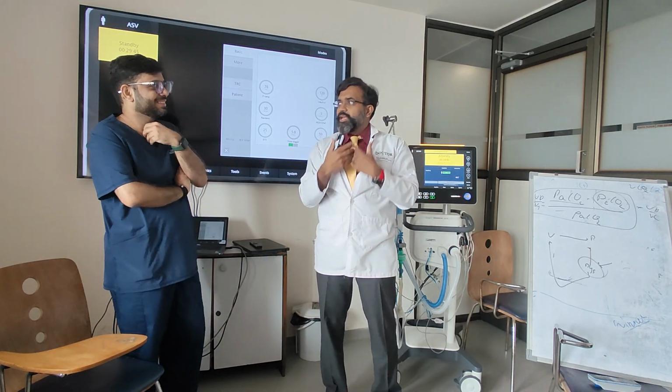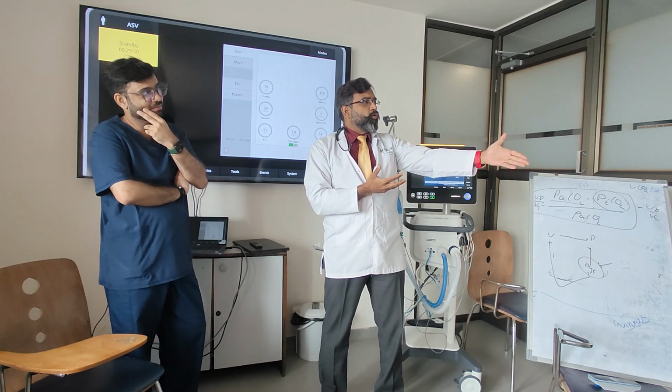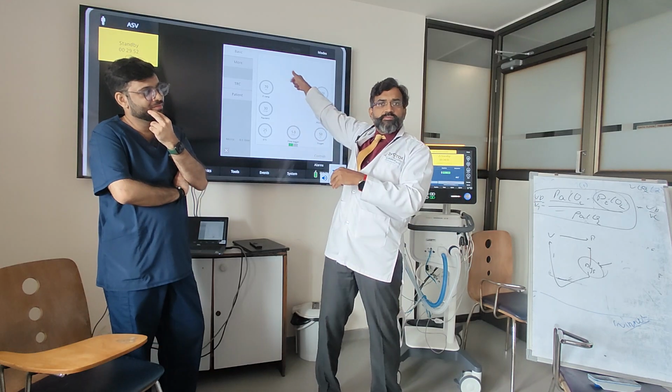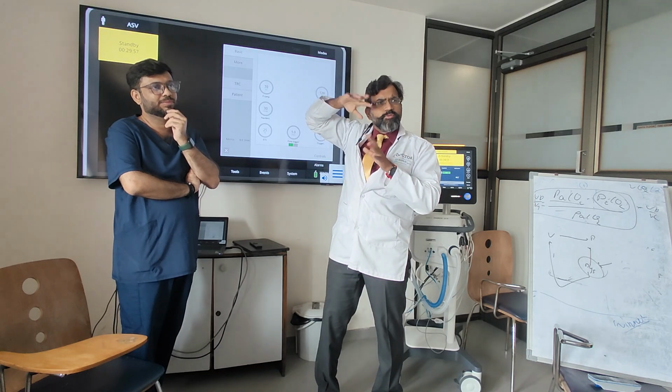I have an example. Why am I telling you this? Because tomorrow when you are ventilating a patient bedside, you should not think, forget the low tidal volume, I will increase the minute volume. That is not going to happen. It's not going to work like that. Are you understanding, all of you?